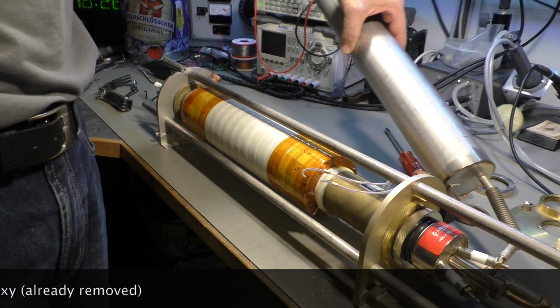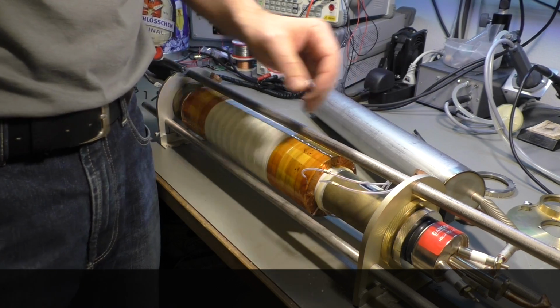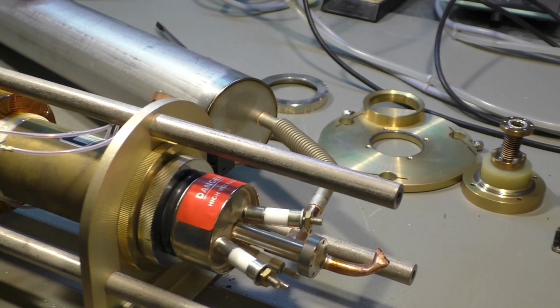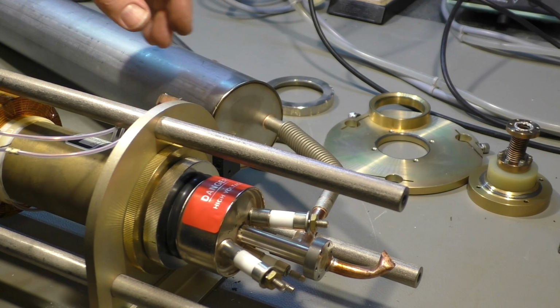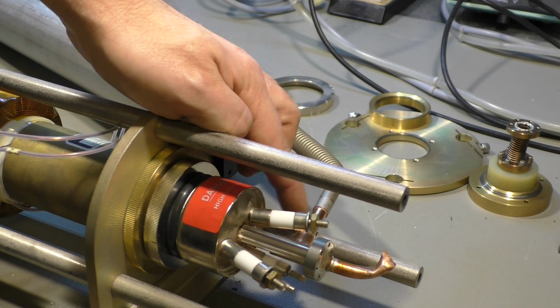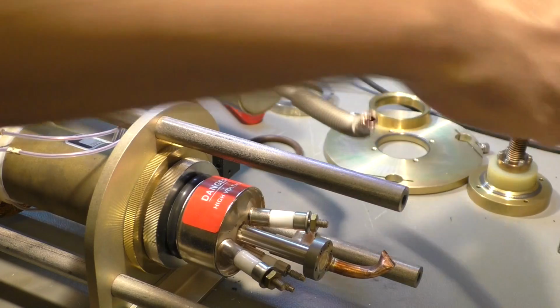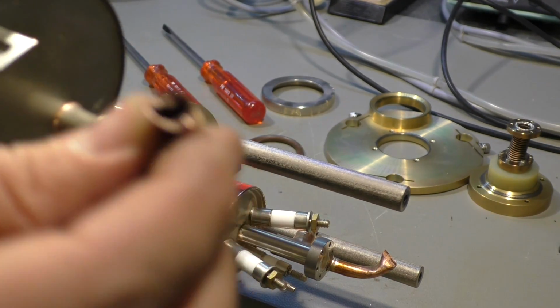I just unscrewed the reservoir tube here. It only has two screws. Now to remove the tube, I had to unsolder this tube here, but that's something I don't want to do now. So I think I simply cut this tube here. Okay, it's just a copper tube with nothing inside.